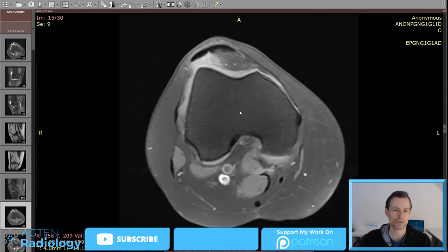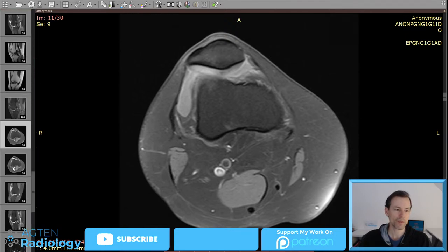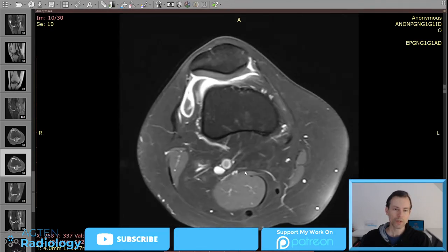Now, this is just one other sequence. And I mentioned that the patient had a background inflammatory arthritis. Well, we don't know whether there are several joints, or whether it's a rheumatoid arthritis or any other kind of arthritis, or whether it's just an inflammatory arthritis of that one knee. So we are not sure there. Because they talked about inflammatory arthritis, what we typically do at that institution, but also in our own institutions, is that as soon as there is something with inflammatory disease, we give gadolinium. This is kind of like a reflex we tend to have. And now it looks like this, right?